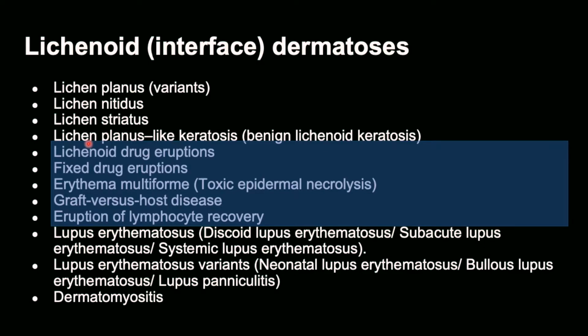This is one of the very difficult situations, and when you look under the microscope, most of the time you will see atypia at the base, especially when you are trying to see in a shave biopsy whether this lesion is AK versus LPLK, you will notice that the atypia at the basal cell layer is usually restricted to the inflammation area and the superficial dermis in these lesions, whereas in AK the dysplasia will be inside or around the inflammation and outside the inflammation.